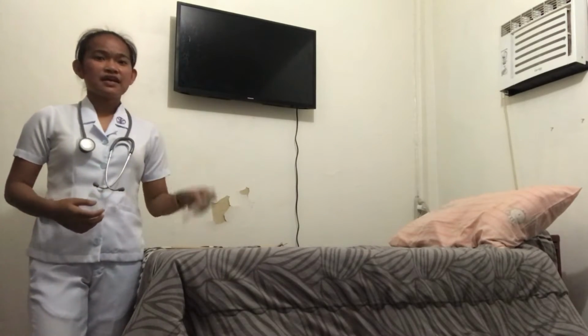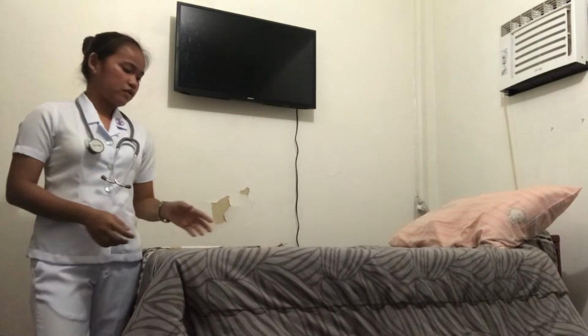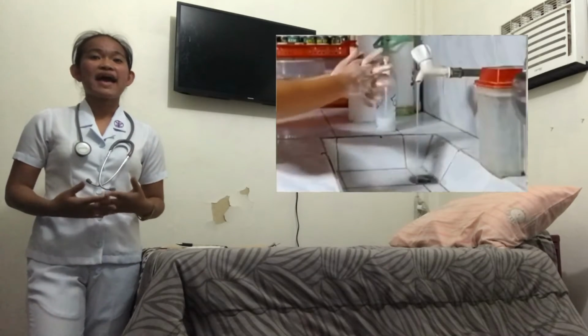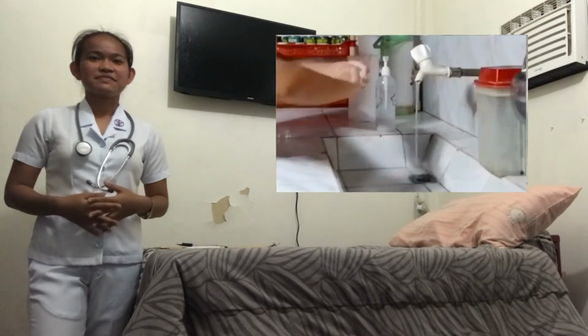Also, we need to prepare the necessary equipment, which includes the stethoscope, the small pillow or rolled towel, the pen light, the watch with second hand, a 2 centimeter ruler, and also the pen and the record sheet. And also prior to the demonstration, we need to perform hand hygiene to deter the spread of microorganisms.